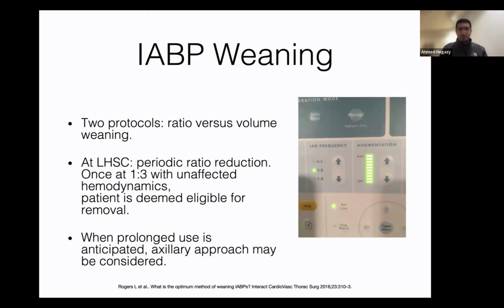And if the patient's ready, everything looks stable on 1 to 3, I will put it back to 1 to 1 until it's ready to come out. Now we've done a test that it can come out. Until the time we're ready to actually pull the balloon pump out, I'll just temporarily put it on 1 to 1 so that it doesn't clot from around it.